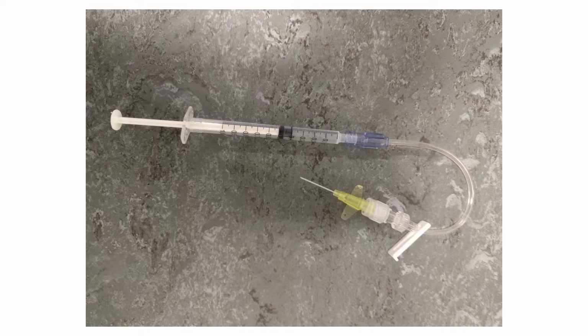No one's going to want to wait 27 minutes for the drug to reach the patient. That just doesn't make sense. So go into your department, get a 1 ml syringe, fill it with saline, connect it up to the IV extension sets and cannulas that you use, and flush it through and see how much it takes to get through the dead space.